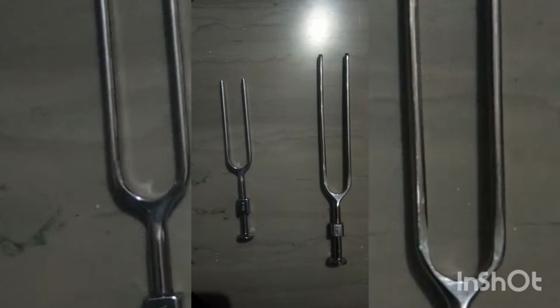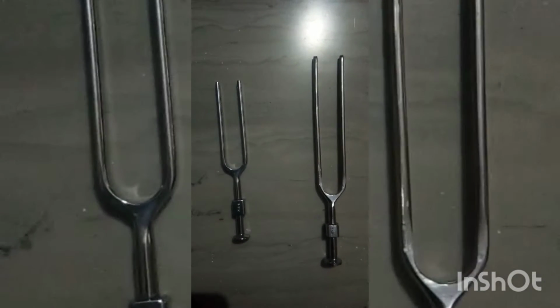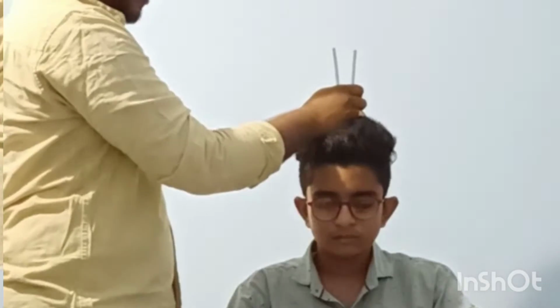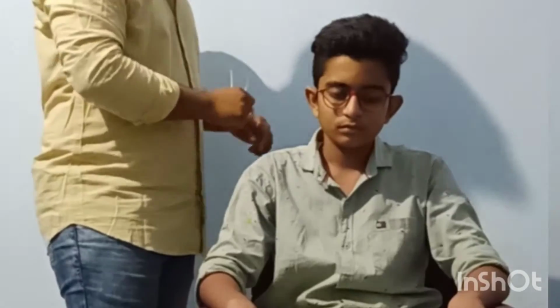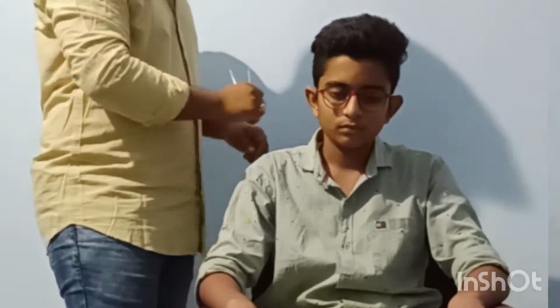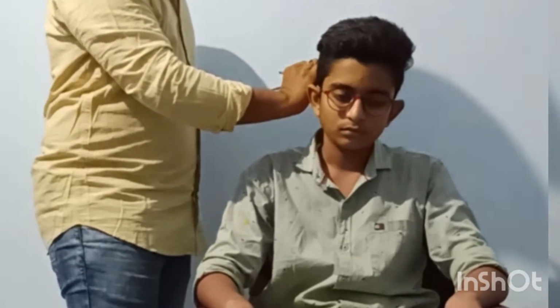Take two tuning forks of 256 Hz and 512 Hz. Place the base of the tuning fork on the mid forehead. Place the base of the tuning fork on the mastoid bone behind the ear, level with the canal. This is the Rinne test, and sound is heard longer in air than bone. And now we'll continue with the examination of the eye.